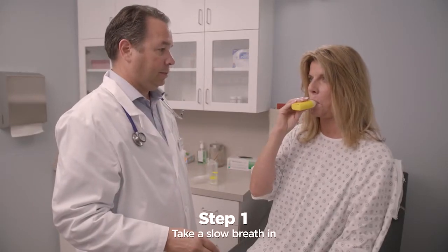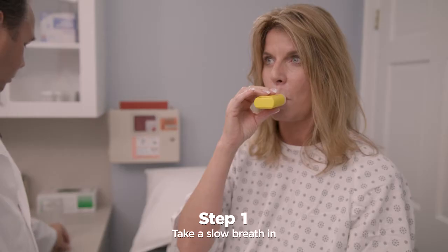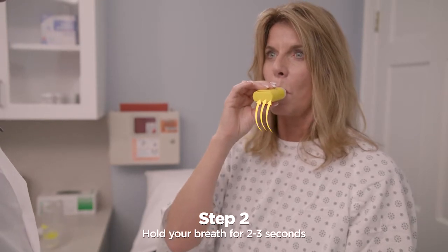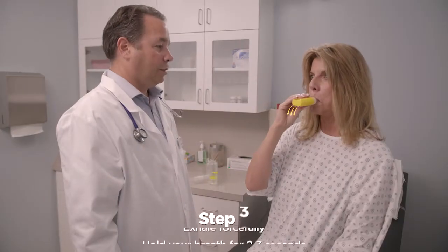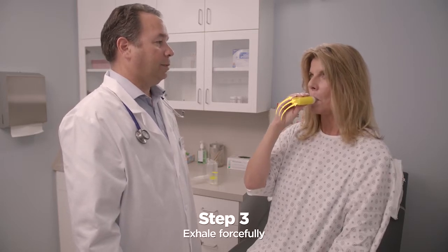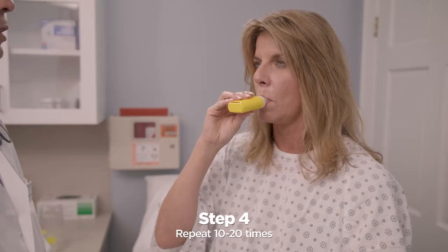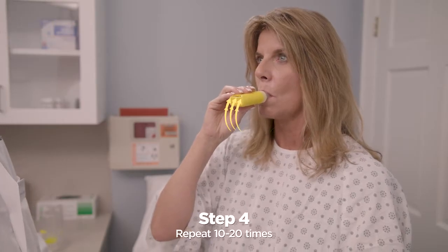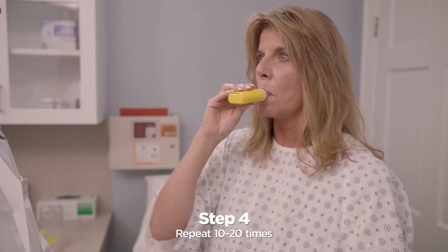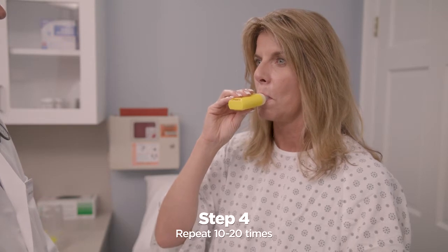Take in a very slow, deeper breath than normal, but do not fill your lungs all the way. Hold your breath for two to three seconds. Breathe out through the mouthpiece with more force than normal. Keep your cheeks flat and not puffed out — this will help you get the best from your treatment. Keep taking very slow, deep breaths in and forceful breaths out through the pocket PEP for 10 to 20 times. Your healthcare practitioner may tell you the number of breaths they want you to take.